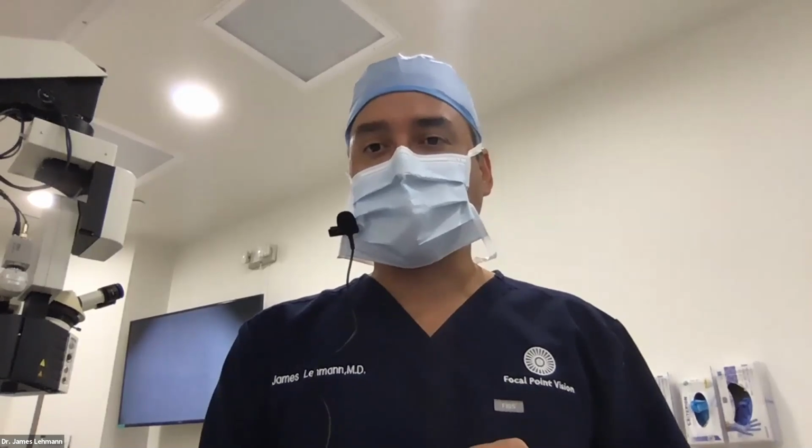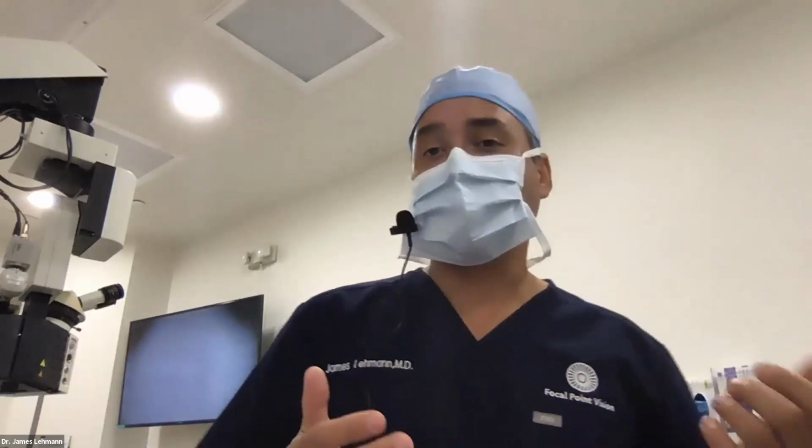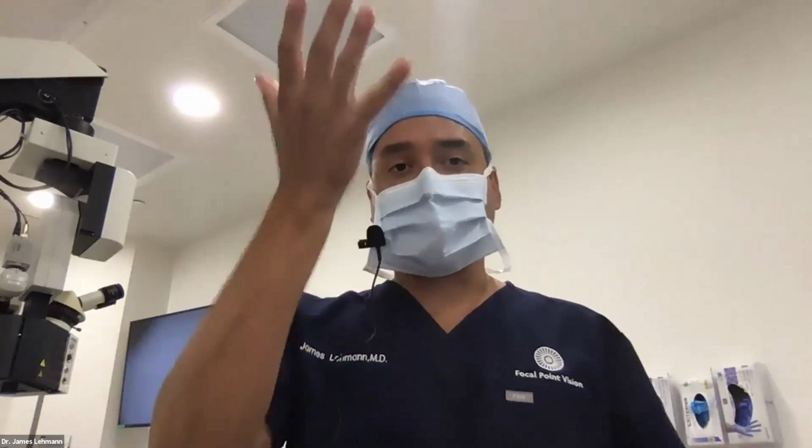Sir, you had removed the second instrument during the last piece. Is it safer? I feel like with modern phaco machines, you're safer removing the second instrument and keeping just the phaco tip in the eye and not protecting the posterior capsule. When you're protecting the posterior capsule, you're pushing on the side port incision, fluid is coming out of the eye, and you have more instability of the chamber.